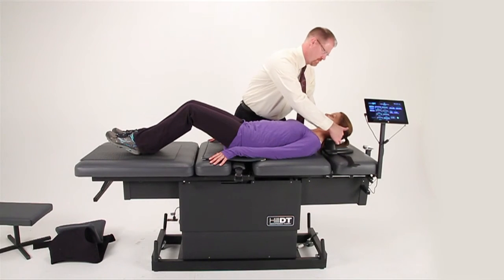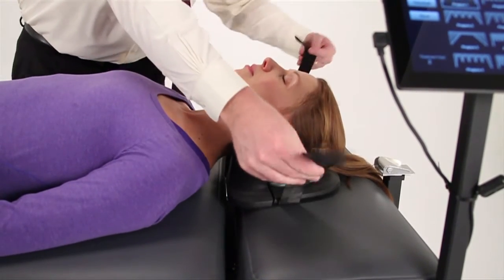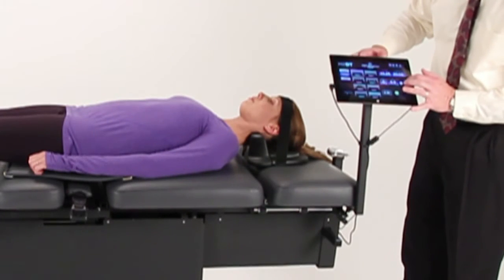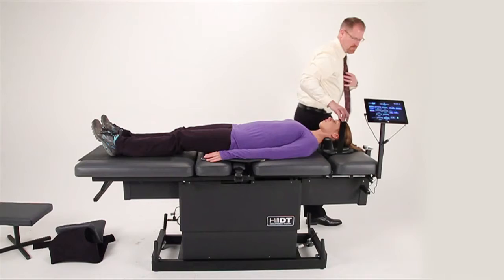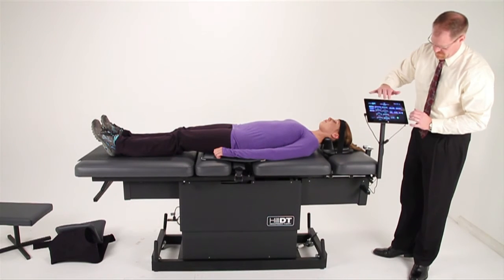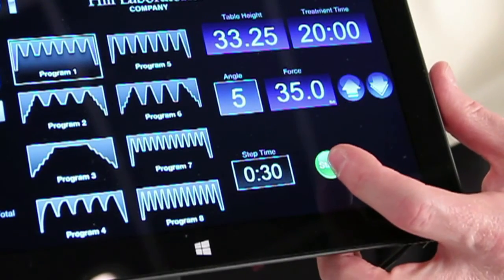Position the patient comfortably into the cervical capture. Gently pull down on the shoulders and then secure the head strap as shown. The cervical cushion also tilts to target the lower discs and to take pressure off of the posterior disc region. Once your patient is in position, choose cervical from the treatment buttons, enter the treatment settings appropriate to a cervical decompression treatment, and when ready, press start.